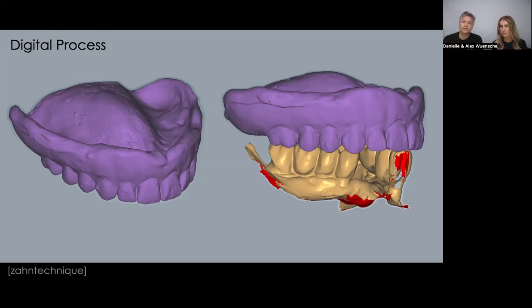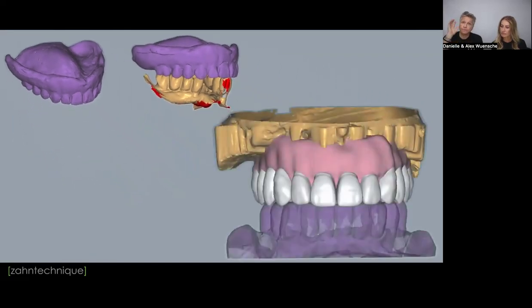We have an existing old denture with a wash impression. The doctor has the denture in the patient's mouth, scans the bite, scans the opposing, and then takes the denture out and scans the denture in 3 dimensions in the doctor's hand. We did some border molding here. That's also important, but that's all in the previous module. Please take your time and check it out. That helps us import these scans and files, set up the digital molds and digital teeth, and set up a digital denture, right?